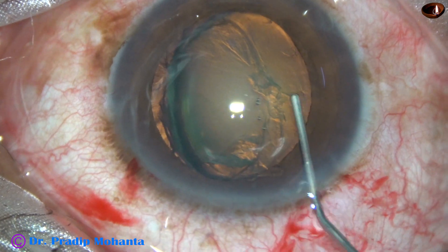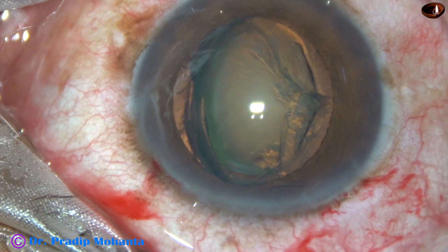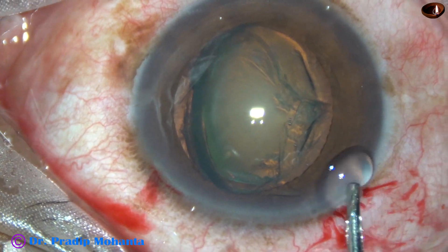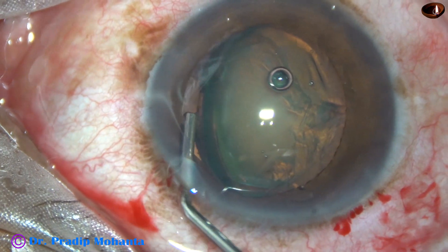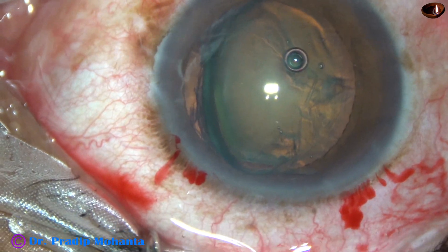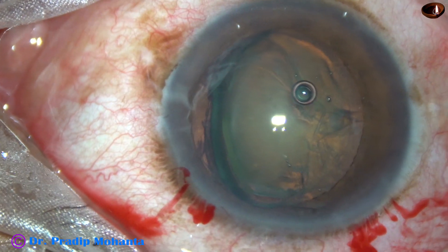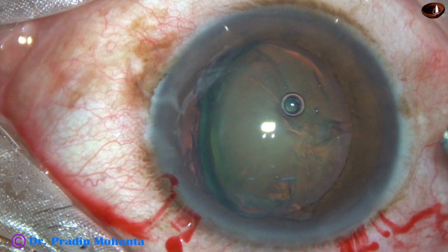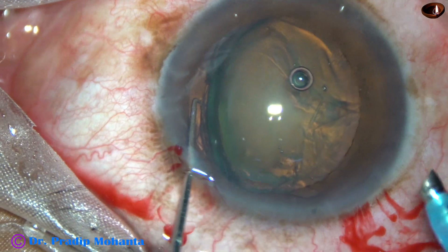Now hydrodissection is done, and one part of the equator comes out of the capsular bag and the lens tilts. Viscoelastic is applied on either side of this tilted nucleus. The chopper is taken to support the posterior surface of the lens mass, and the phaco probe goes in with its bevel facing the lens mass.